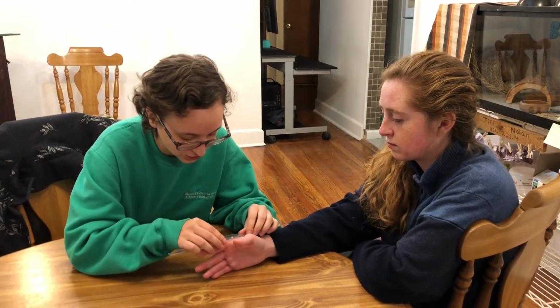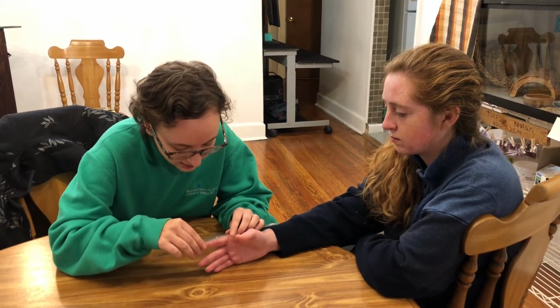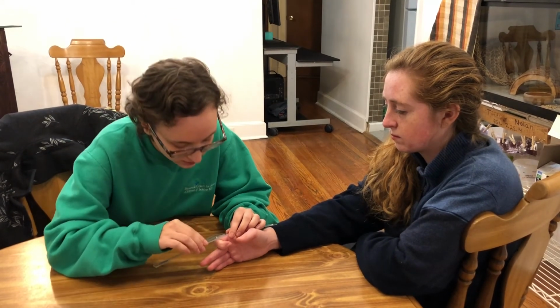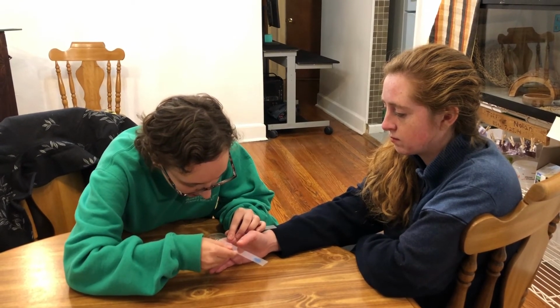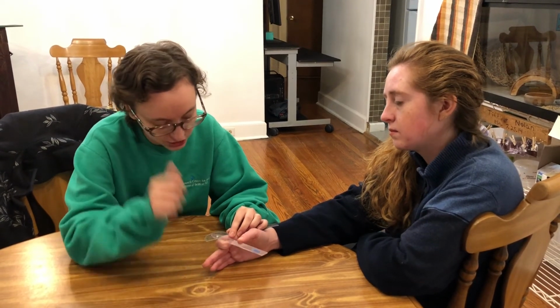And now I'm going to do PIP, which is this middle joint here of the finger. So I have essentially just moved my fulcrum up to the PIP joint. And what I want you to do is just bend your finger like so. Great. Okay, and I'm getting 110 for PIP flexion.